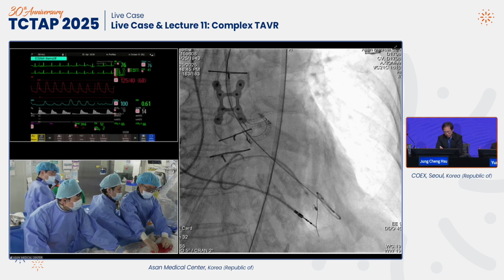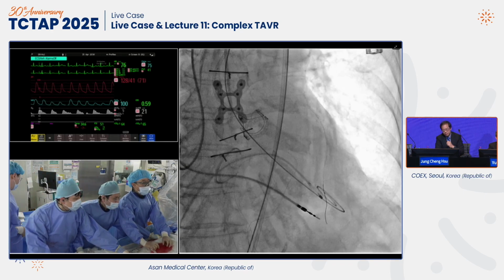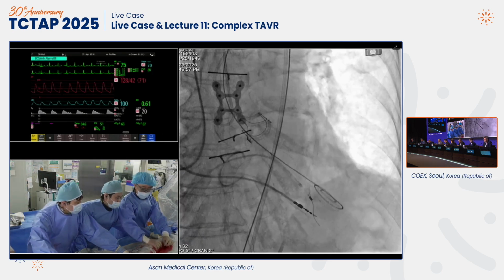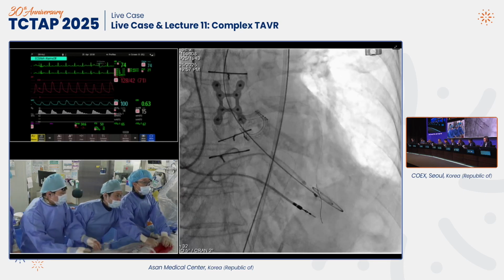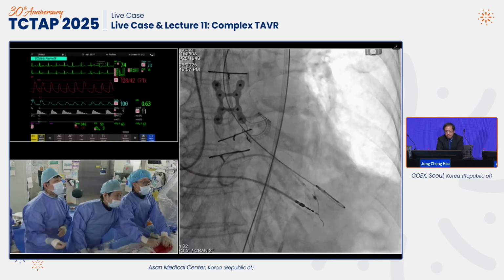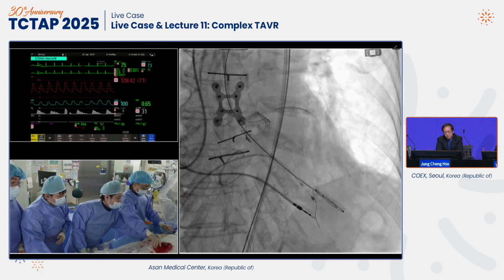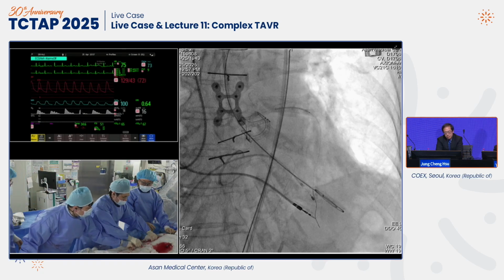Our team doesn't have much experience with BASILICA. We prepare the coronary protection, as there would be some very high risk of coronary obstruction. We're going to consider chimney stenting. We have already put the wire through the guiding catheter to the LAD, and then we will put this, the Megatron stent, 3.5 by 24.